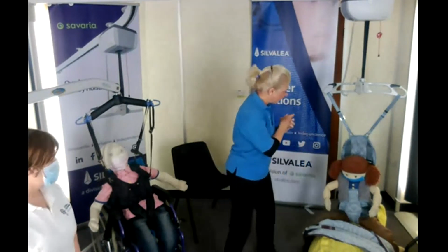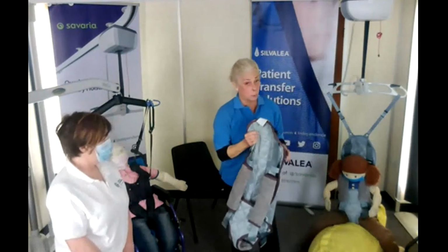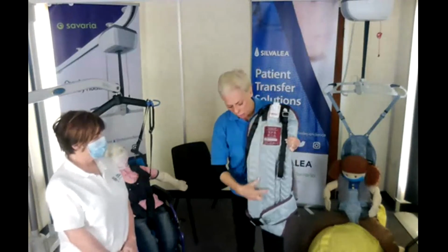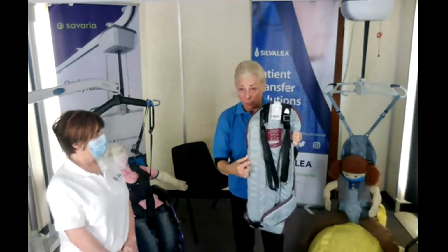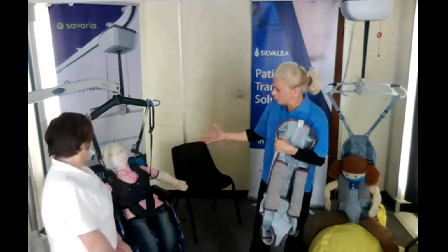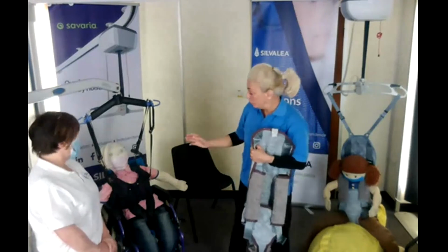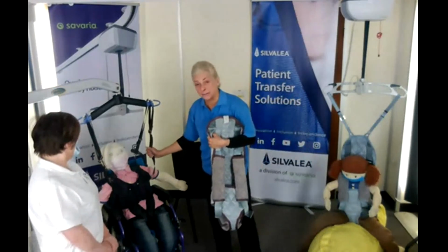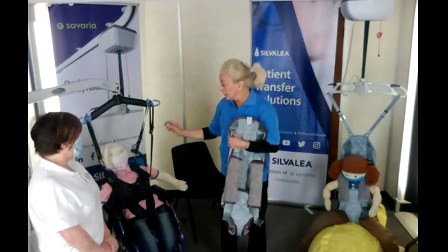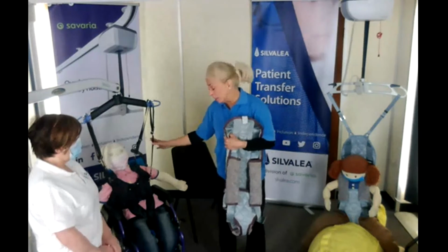So going back to the Jolly Jumper, this is I think a really good supportive harness. It's got a really big, long back section with full bones in the back, so it will give someone a little bit more support. So the Rachel harness, you've probably got to have some head control, otherwise you'd be lolling about. However, we have done little strips that go over the tapes if that is the problem. The harness is good. It suits the situation, but if you're worried about protecting them with the straps, then we can cover them.